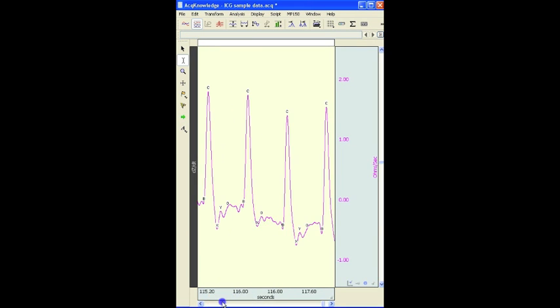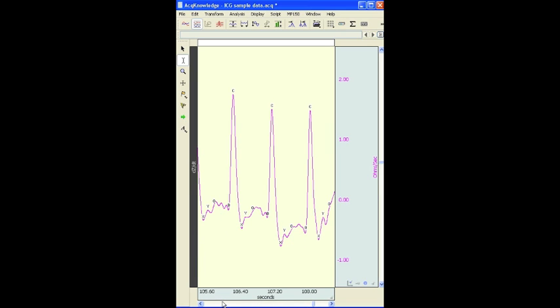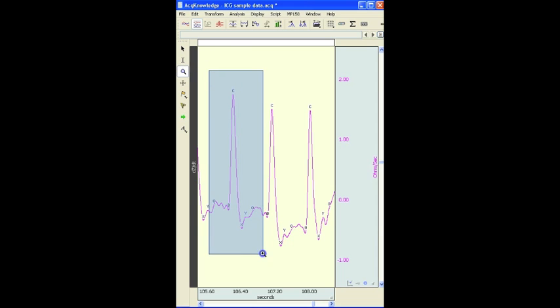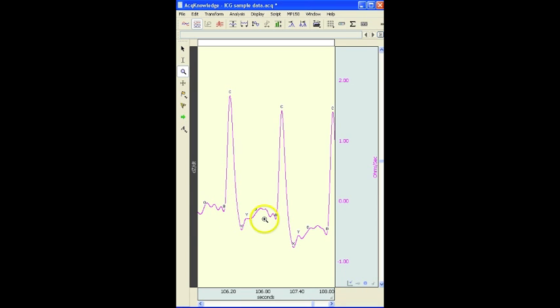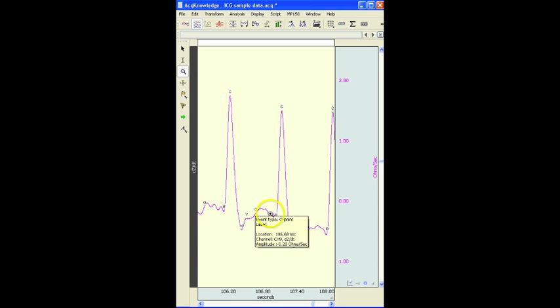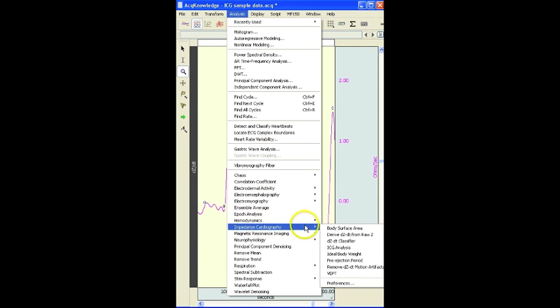Now the software has gone through and, if we zoom in a little bit more, labeled the different points of the component, B, C, X, Y, O, etc. Now these points are used in the ICG analysis.